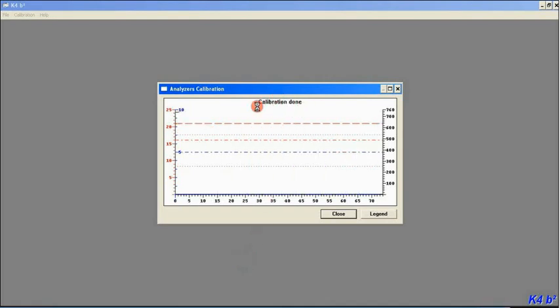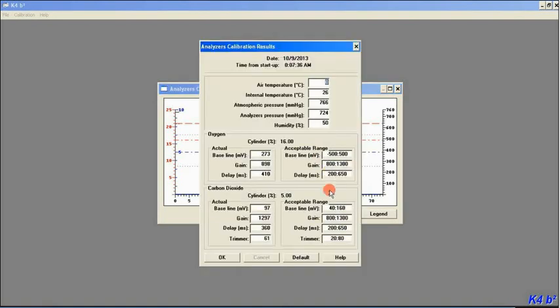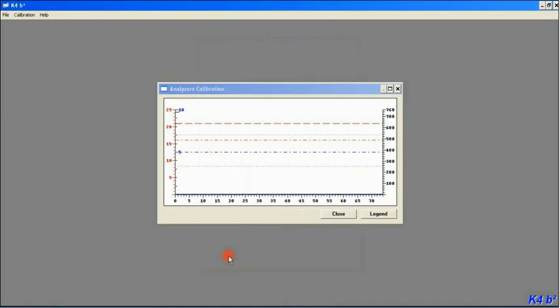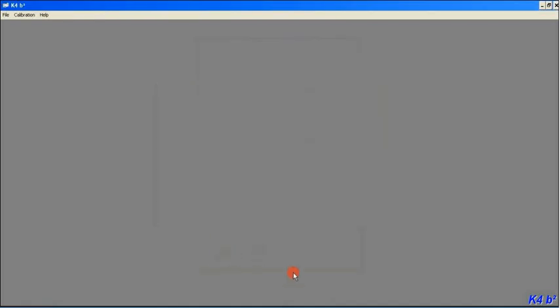Calibration done. You'll see acceptable ranges. You want to make sure that your ranges that you got were within those acceptable ranges. If they're not, you're going to have to troubleshoot and find out why. Otherwise, if you're good, go ahead and click OK and you're good to move on.